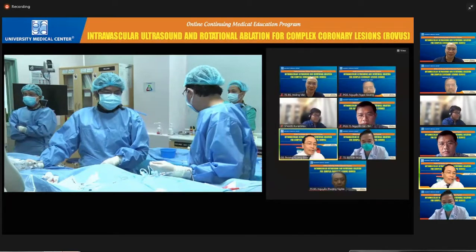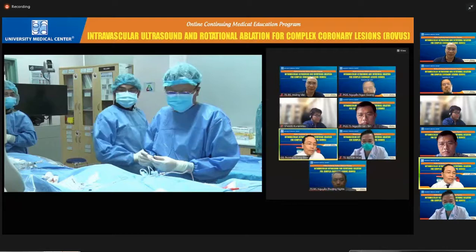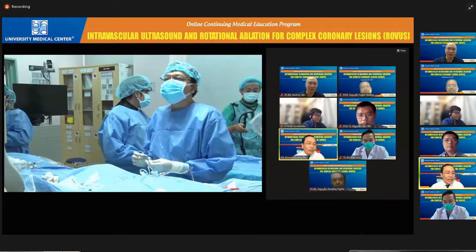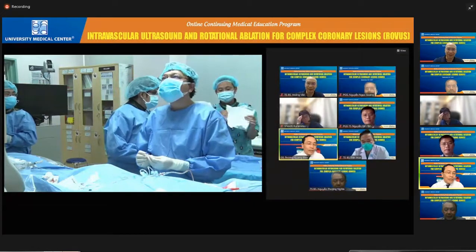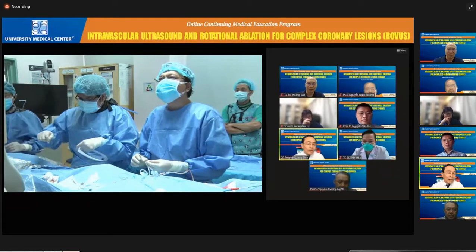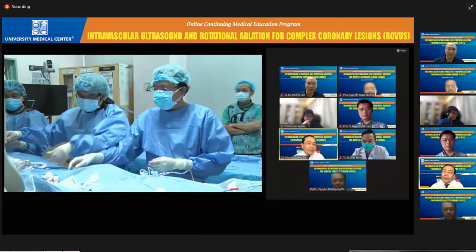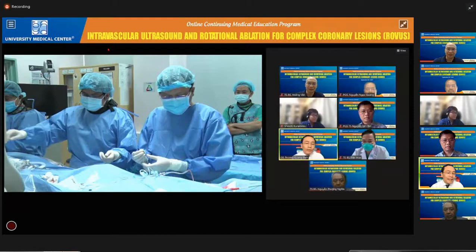But if you have enough equipment, for example IVUS, and you do more than 300 cases a year, with 15 left main cases per year, you can use the DK crush technique. It may be better than a provisional technique. What do you think about that, Professor Nguyễn Văn Tân?